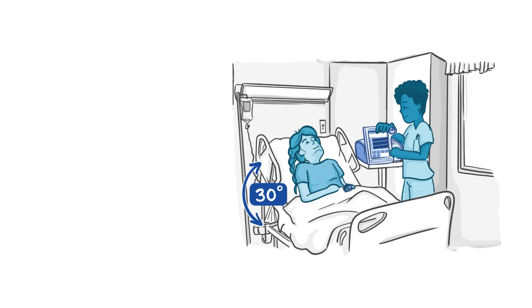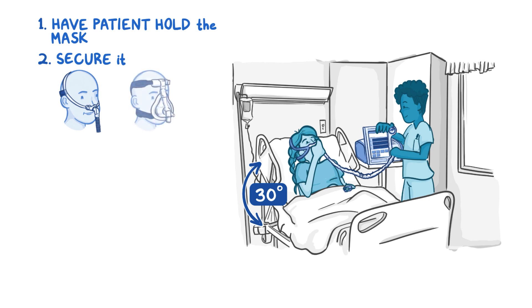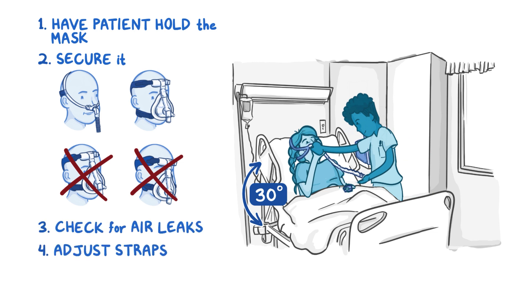Now that the initial setup is complete, have your patient hold the mask on their face until they feel comfortable breathing with the ventilator. Give them a few minutes to get used to the mask before securing it. The mask should fit snugly over your patient's nose, or for a full face mask, over your patient's nose and mouth. The mask shouldn't dig into your patient's eyes or nose, or hang over their chin. Run your fingers along the edges of the mask to check for air leaks — you don't want any. Adjust the straps if you feel leaks or if the mask is uncomfortable.